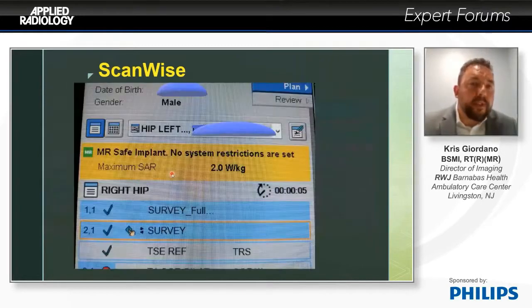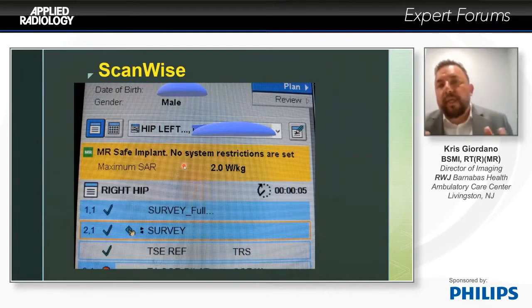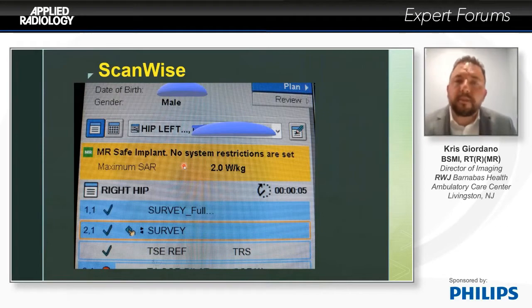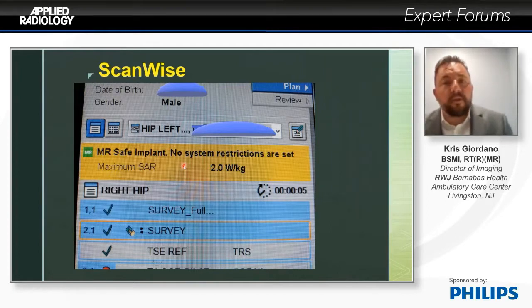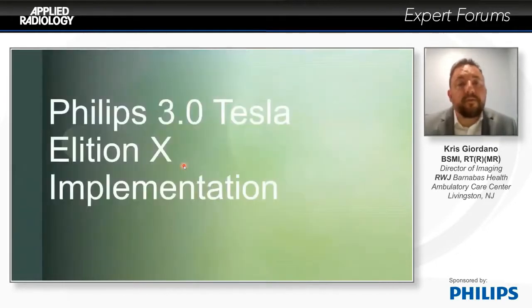And then we can really appreciate the fact that it comes right up on our system that we have everything in front of us. We have a screen capture that we can take, that we can send back to PACS, that we have that forever record of: here it is, here's the patient's limitations. We stayed within those restrictions, to keep the patient safe, regardless of what that limitation is, regardless of what that restriction is, that we're able to maintain their safety throughout.